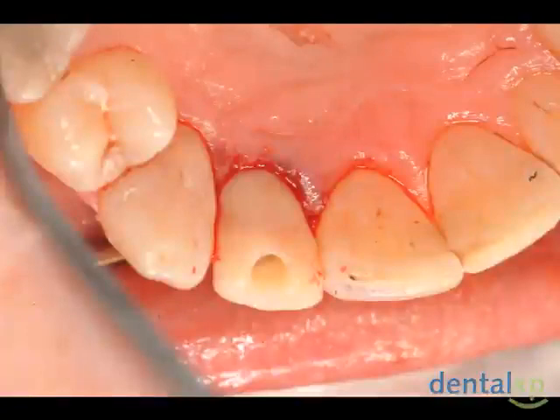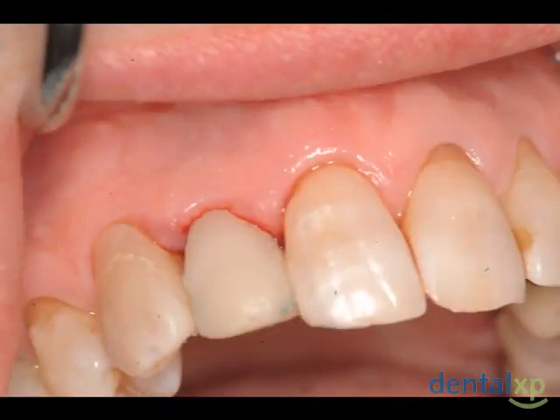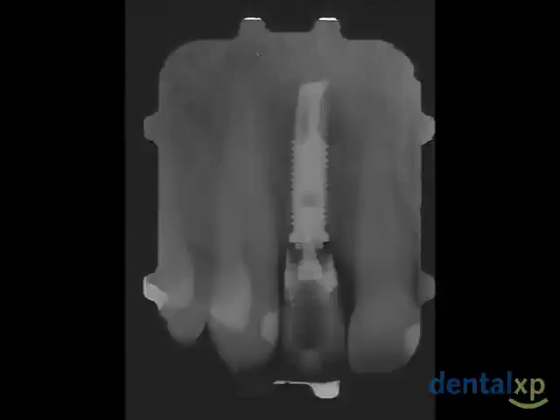Notice that the access hole here is well maintained, so it can be screw retained. The access hole is then filled with resin. The provisional implant crown is in place, contouring the tissue. The provisional crown has been in place and the tissue has healed to create the proper emergence profile. An X-ray view of the provisional on the implant.